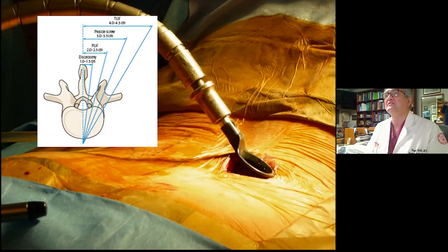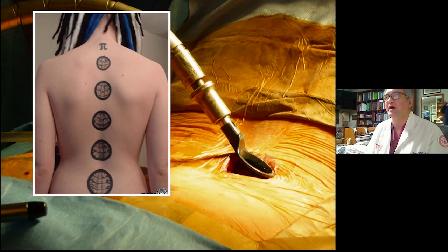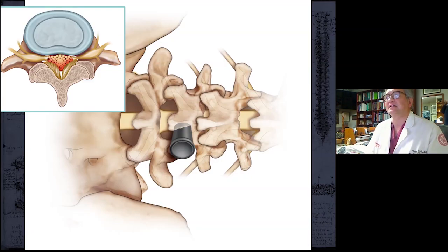We use different types of retractors for this operation. For microdiscectomy, we use 14 or 15 millimeter tubes. For laminectomy, 18 millimeter, 21 for TLIF, and then 24 for spinal tumors that we treat also with this type of technology in the lumbar spine, intradural, extramedullary. This is not relevant. Now, this is a patient that we are treating here for lumbar spinal stenosis at L4-5.